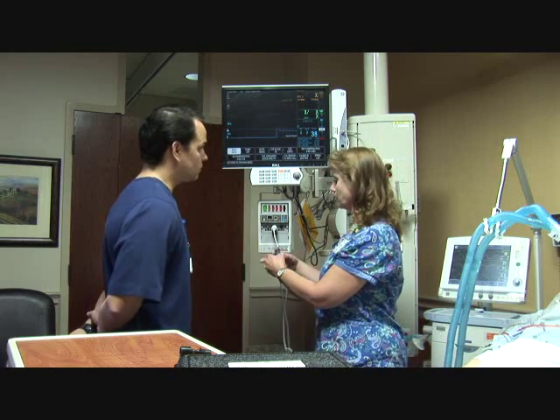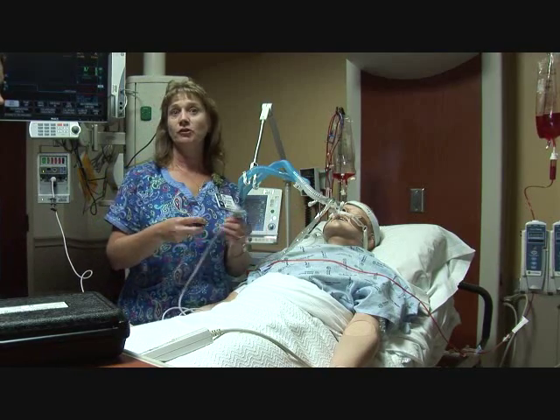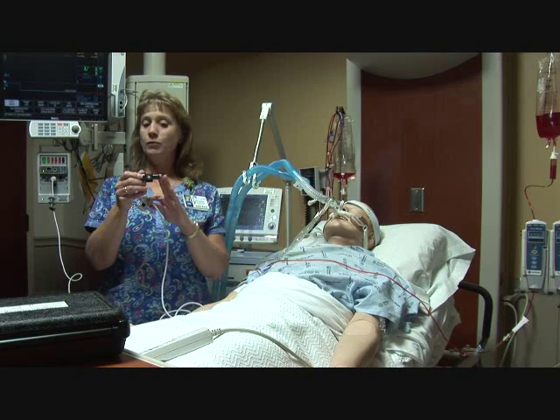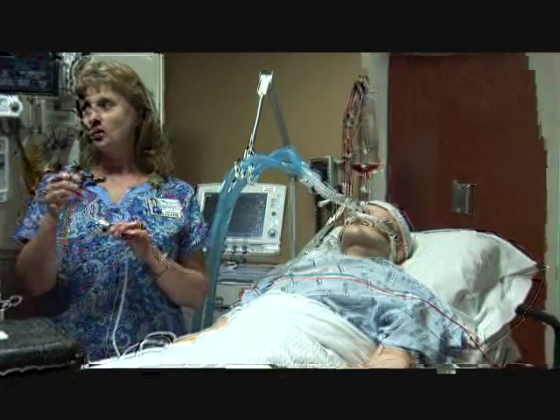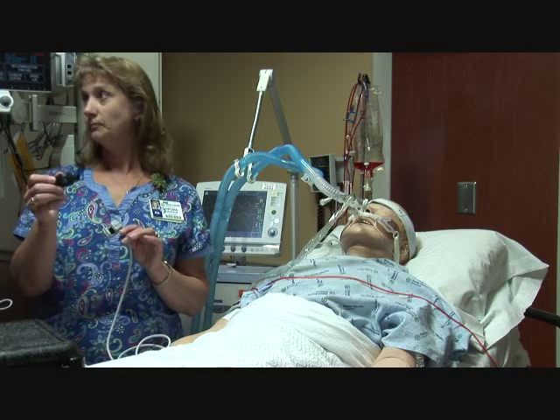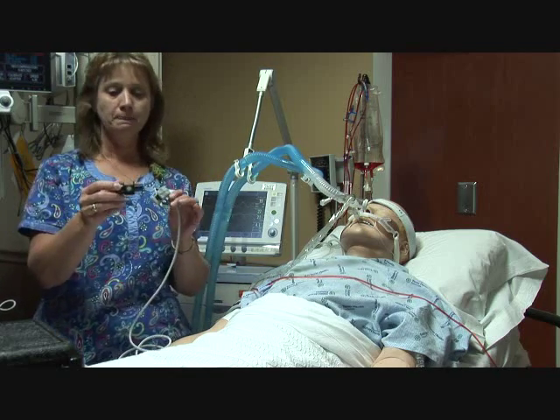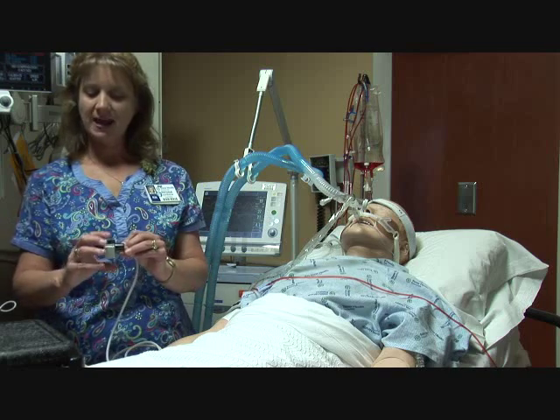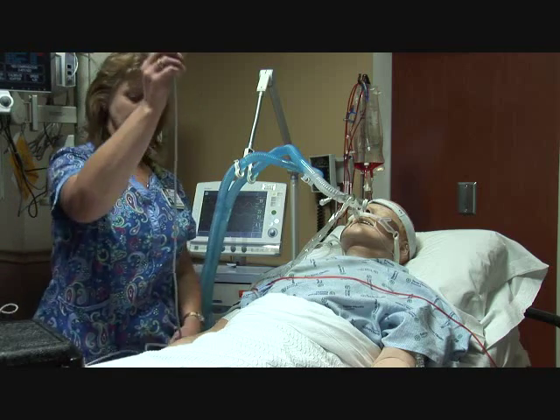Okay, so you're going to take this off. You're going to take your analyzer adapter. There are two different types. The black one is a permanent adapter, and then there are clear ones that are disposable. We've got the permanent one, so we'll have to properly wash that one when we get done. You take this, and there's a white arrow here, and a white arrow here. So you would just snap that in. And then we're going to get ready to attach it to the patient.